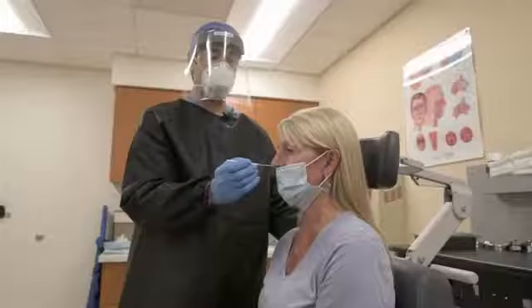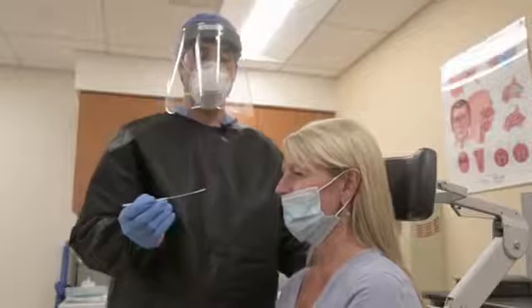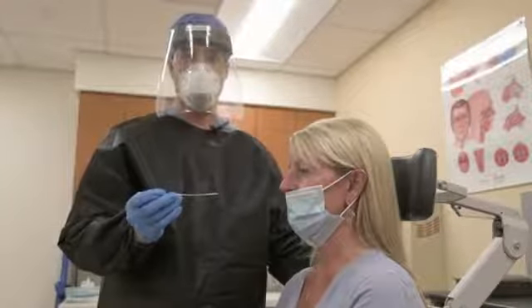You may also experience a patient who tries to grab your hand and pull the swab out of your nose. If this happens, you need to talk to the patient and explain that you have to try again on that same side in order to obtain an adequate test.